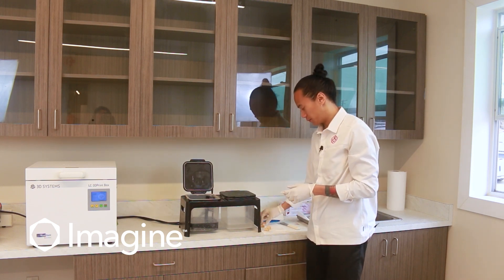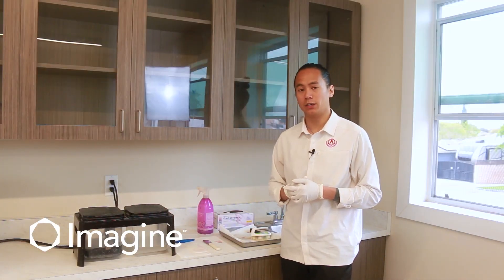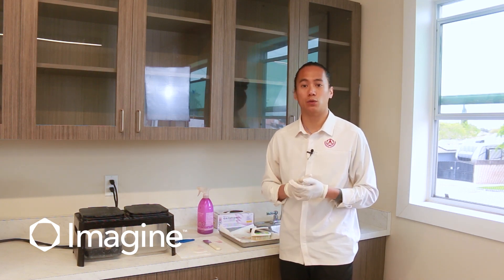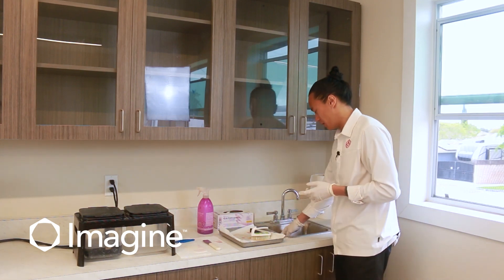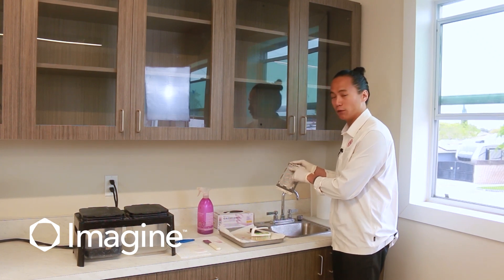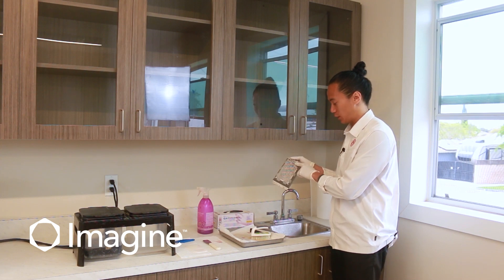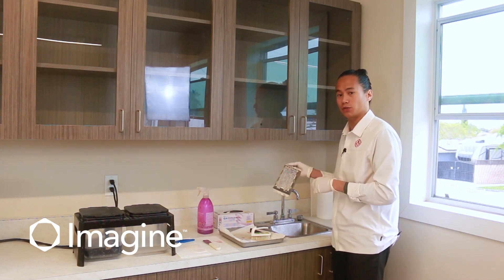While you're waiting for your units to sit in the alcohol bath or when they're in the light cure, make sure that you take the time to clean your accessories as well as your print platforms. It's important to clean your print platforms thoroughly to ensure there's no leftover material in the preparations, and that your print platform is smooth to the touch so that it doesn't puncture your resin tray.